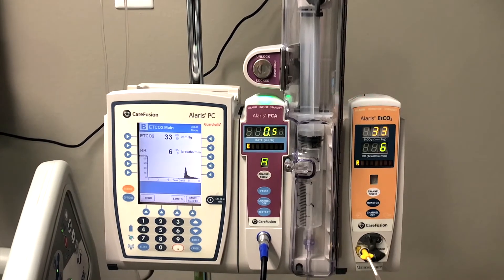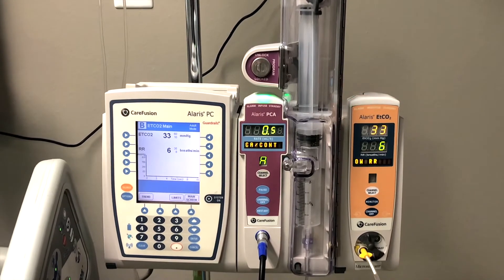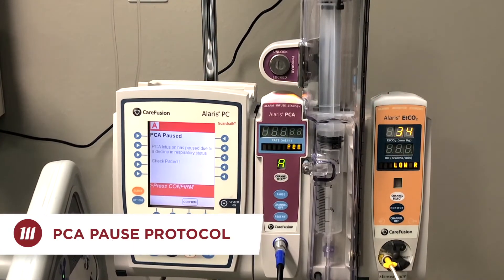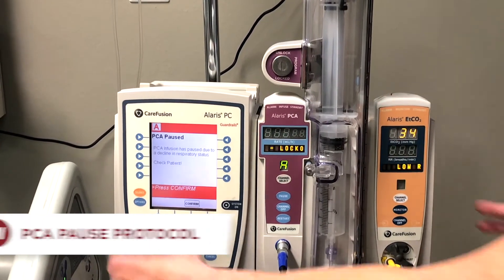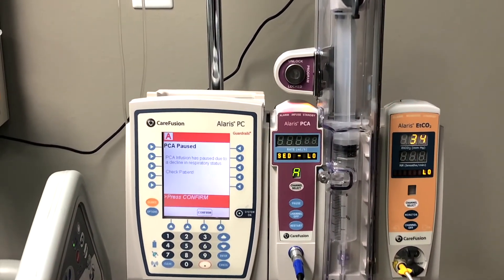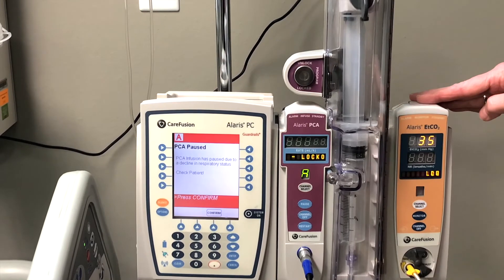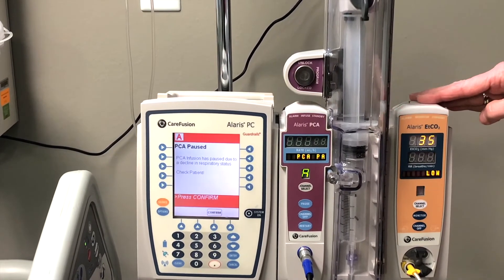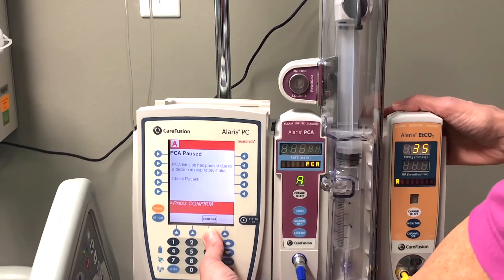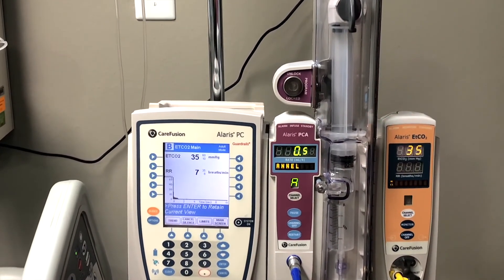We're going to tell the patient to take a big deep breath so they can come out of that alarm. And now we're in a pause protocol. The patient did not come up enough and recover enough because it dipped below the settings that were set in the end tidal module. So at this point we're coming in the room, stimulating the patient, probably turning on the oxygen, and making a phone call to the physician to let them know that the patient had dipped below the settings and a pause protocol had occurred.